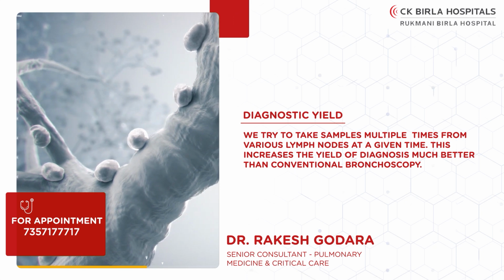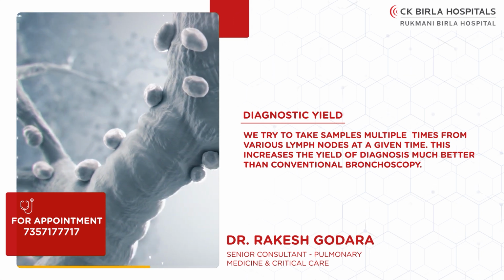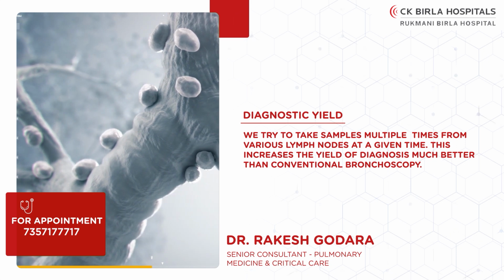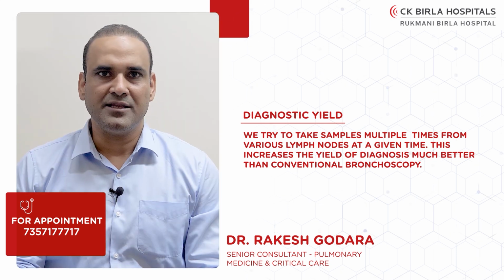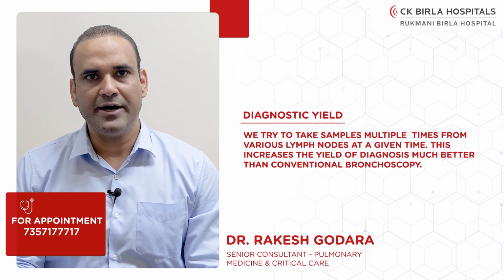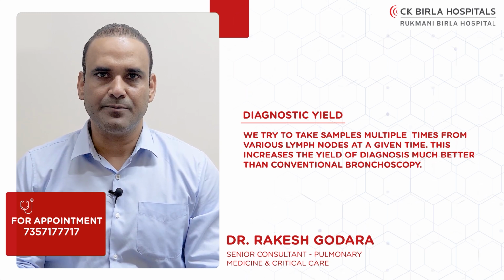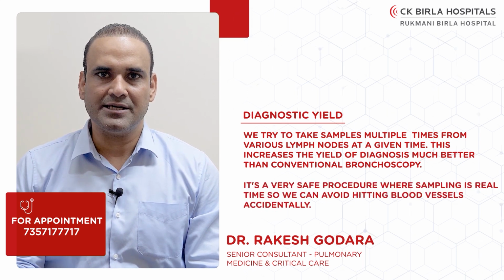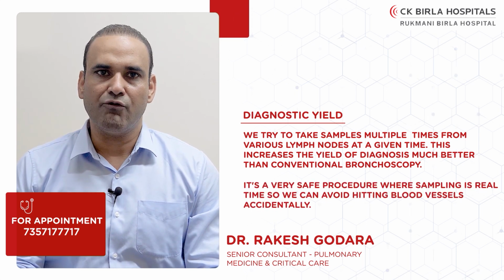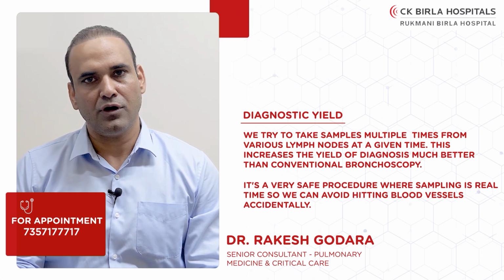We try to take samples multiple times from various lymph nodes at a given time. This increases the yield of diagnosis much better than the conventional bronchoscopy. In the majority of cases, it can avoid the need for video mediastinoscopy, which is a surgical procedure. It is a very safe procedure where sampling is done in real time, so we can avoid accidentally hitting a blood vessel along with the lymph node or the mass lesion.